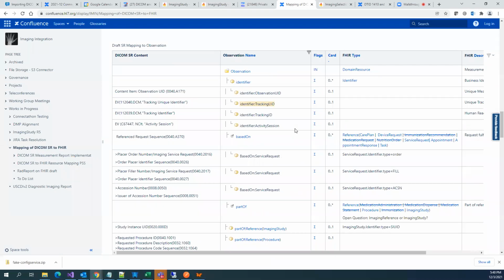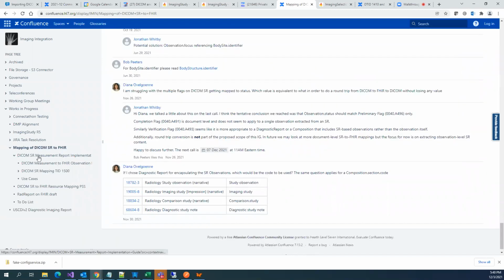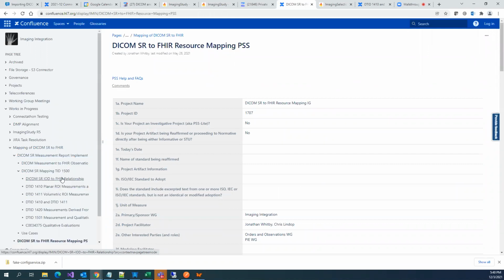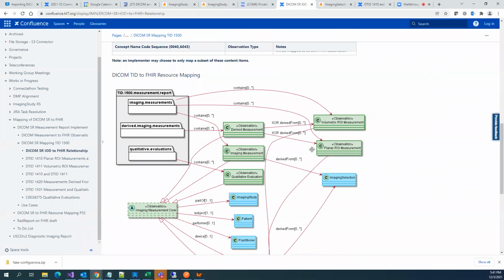Before I show this one, I'll show you a high-level view. There is a nice diagram which I want to take. Yes, this is a good diagram to explain.